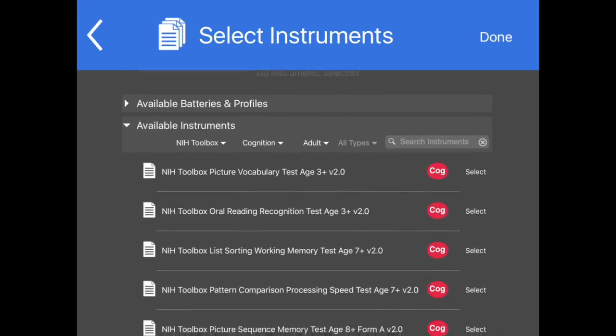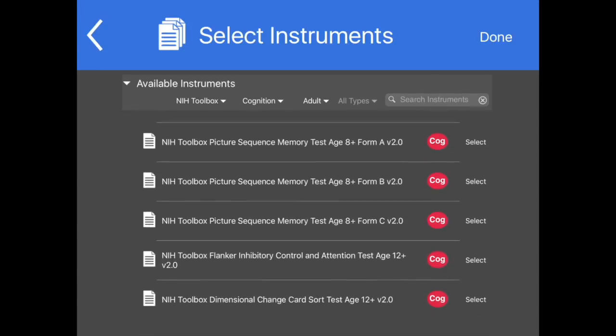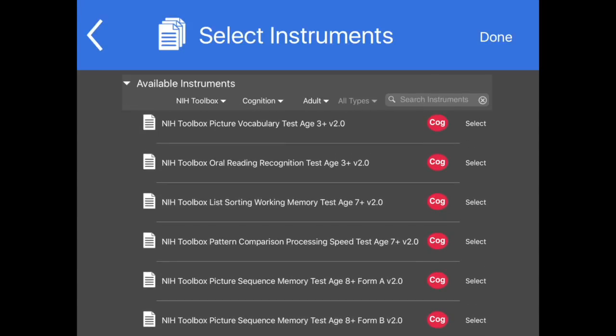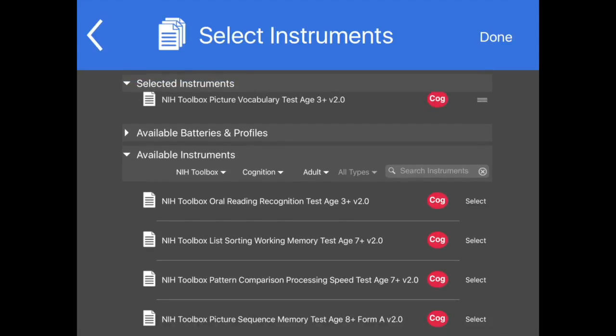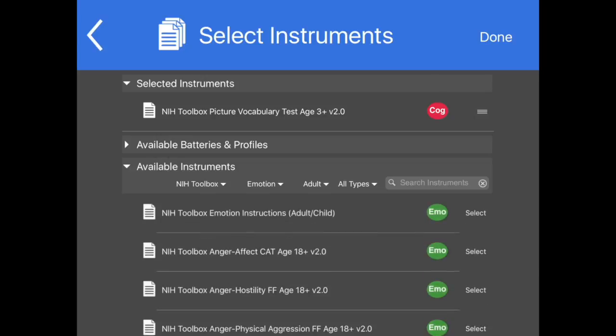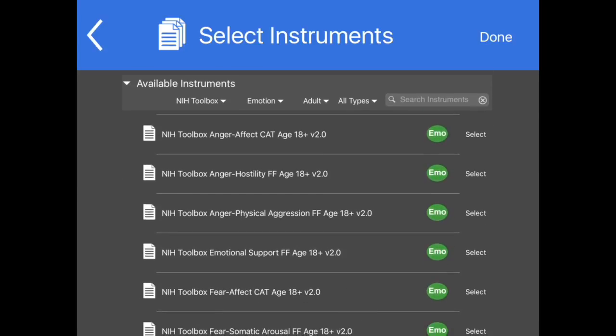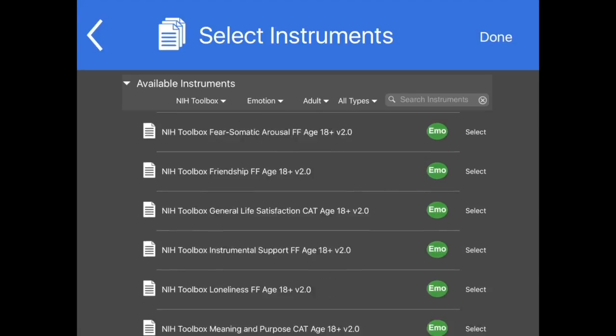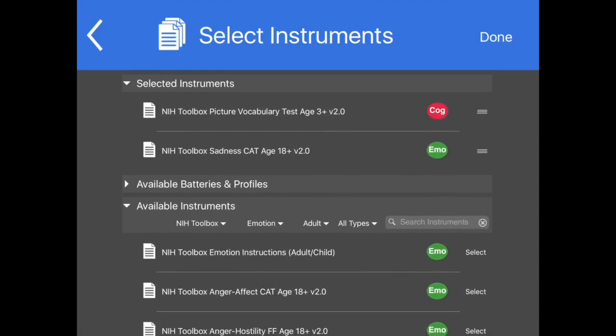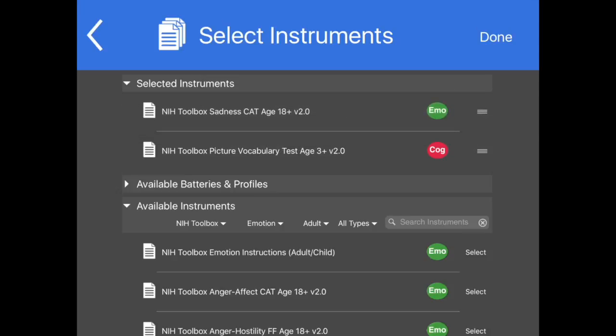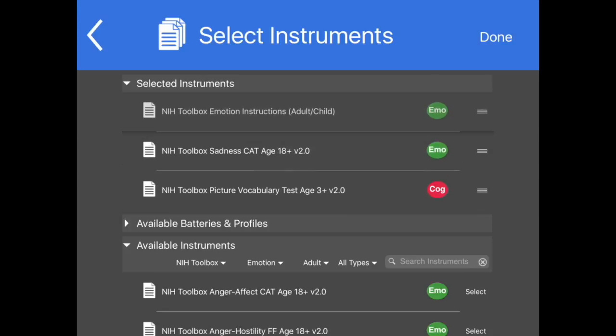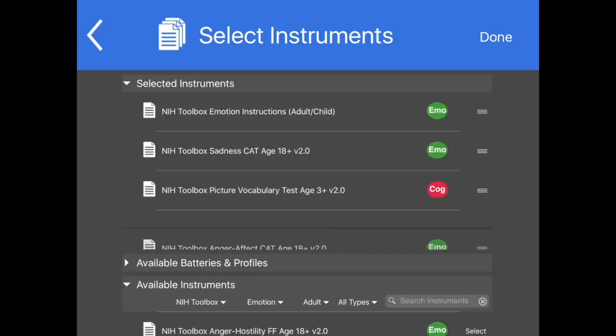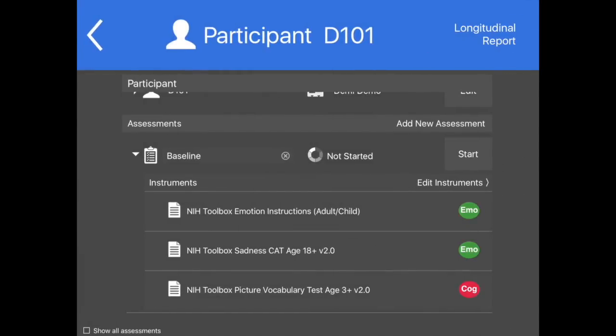Selected Instruments will move to the upper part of the screen and will be listed under Selected Instruments. Reorder Selected Instruments if desired by dragging them up or down using the symbol to the right of the instrument name. You may also drag an instrument out of the Selected Instruments section using this same action. Tap Done in the upper right corner of the screen or tap the arrow in the upper left corner to save your selections and to return to the previous screen.